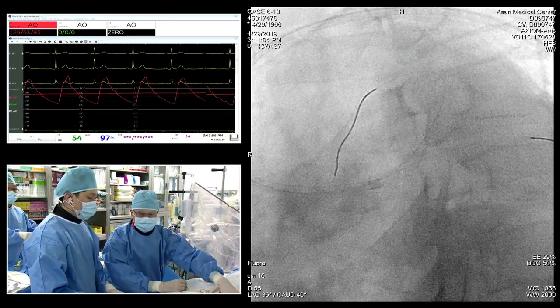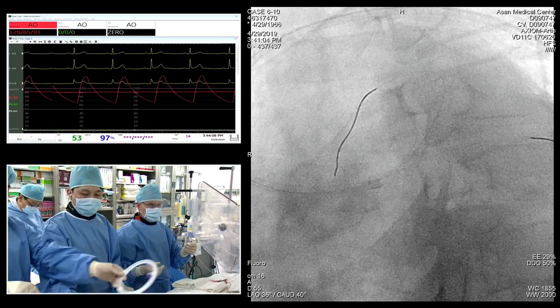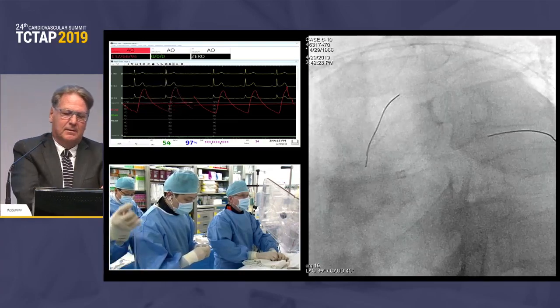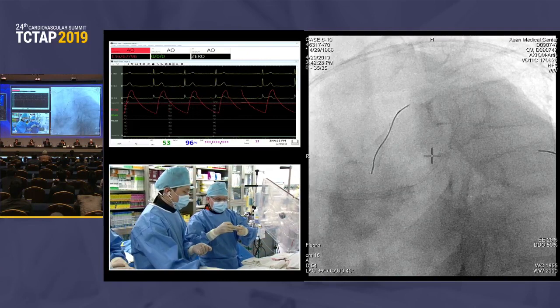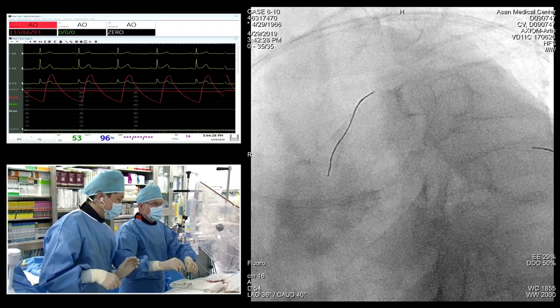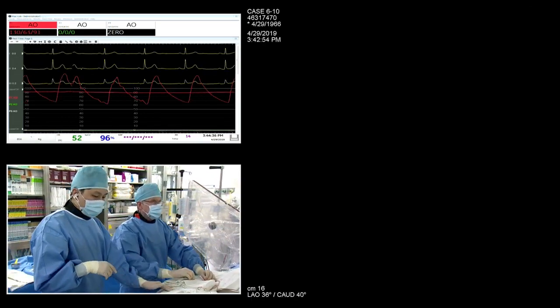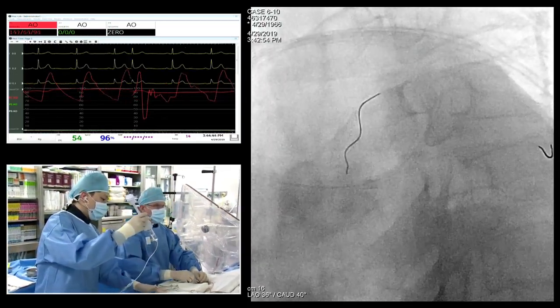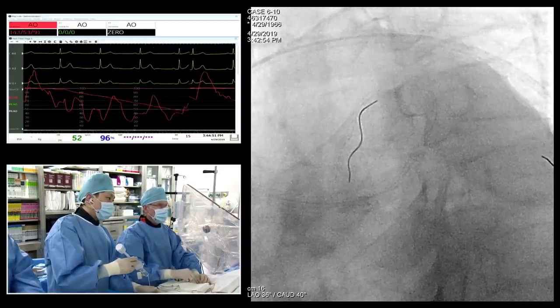So we go with a brand new Trio semi-compliant, 12, 15, whatever you have. 15. Okay. Did you choose a semi-compliant because you think it's more likely to cross than a non-compliant? Yes, exactly, and I don't want to do a high pressure dilatation. I just want to give a little bit of massage. Okay, let's prepare also the 3.5. Open another inflation device. Let's prepare the 3.5, the same that we used to pre-dilate. We can hang a little bit proximally because it's very big, so we're not going to dissect. We want to make sure that we don't go outside the stent.